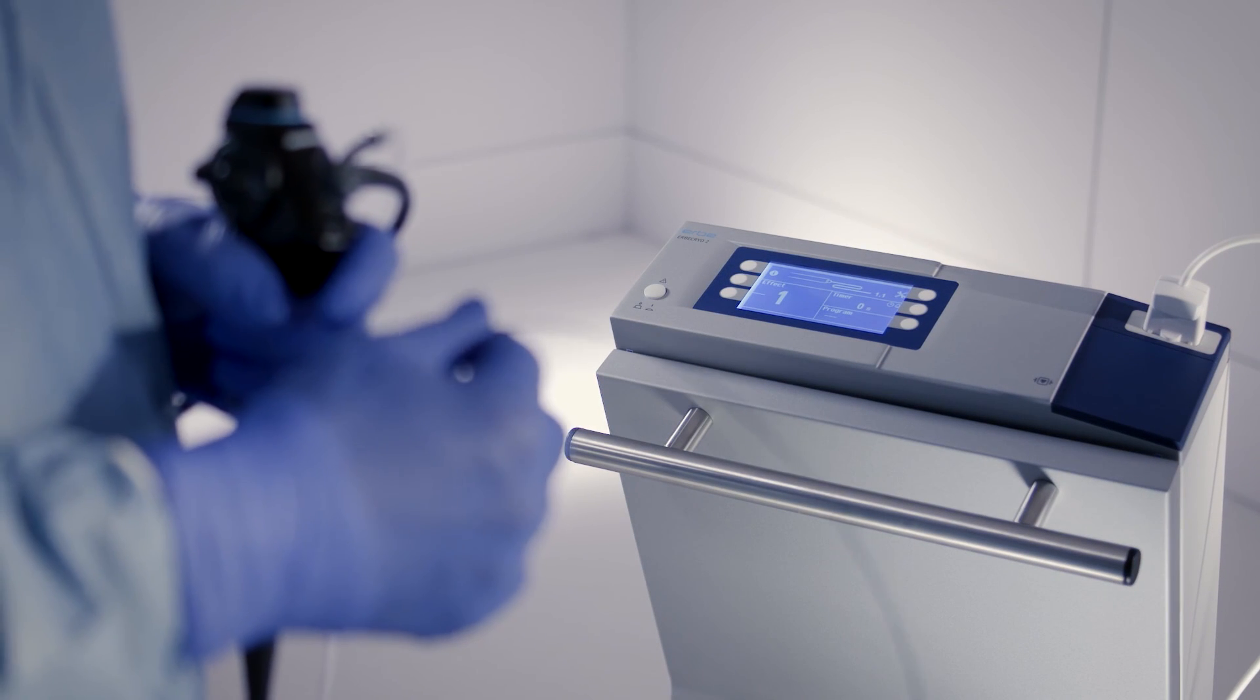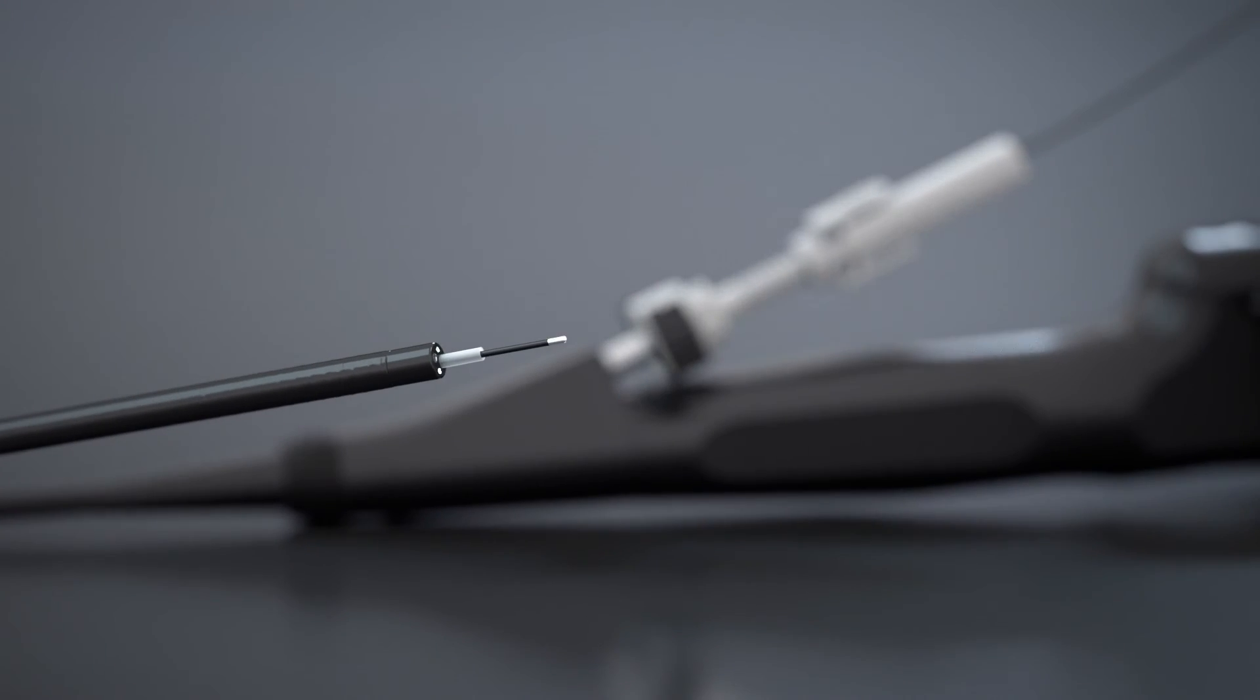With this unique extraction technique, the physician always maintains visual control and is able to react quicker to complications.